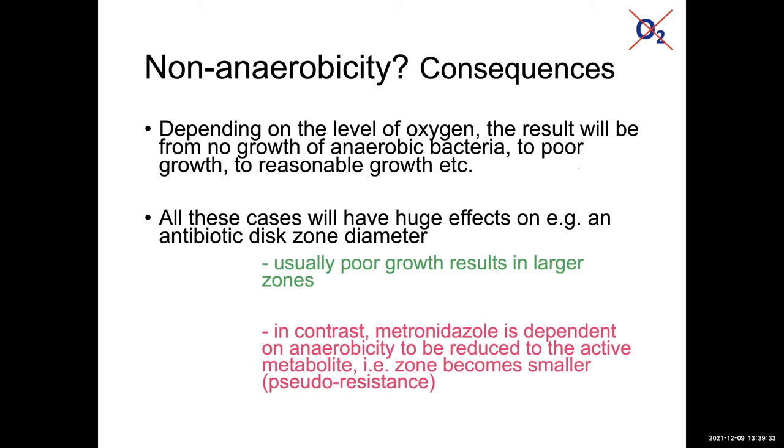In contrast, we have metronidazole, which is dependent on the anaerobicity to be reduced to the active metabolite, which kills bacteria. And if there is oxygen present in the atmosphere, this will not happen. And the zone can become much smaller, a phenomenon that we call pseudo-resistance. Next slide.